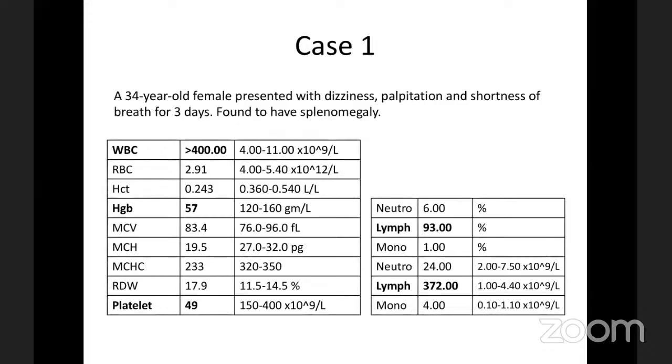Through the cases, we'll go through the findings in leukemia and lymphoma, the most common ones, maybe not everyday cases, but at least you can see them.